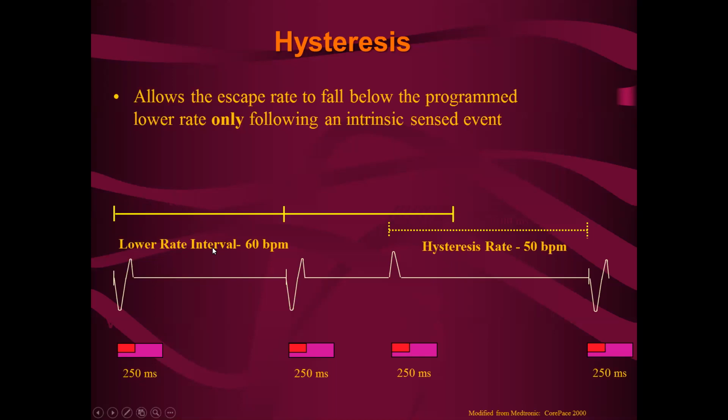So this feature is really only useful for patients that we know have their own good intrinsic rhythm. If somebody is paced all the time, there's no sense to turn on a hysteresis rate. There's no need for that.